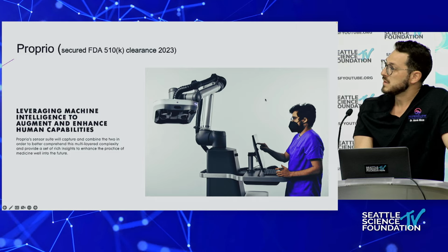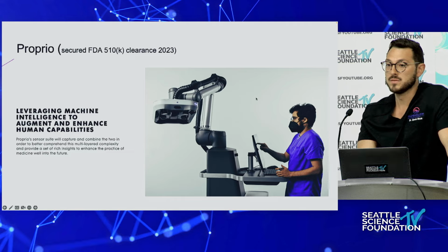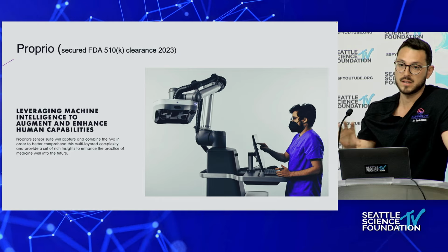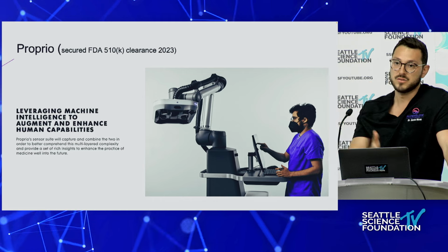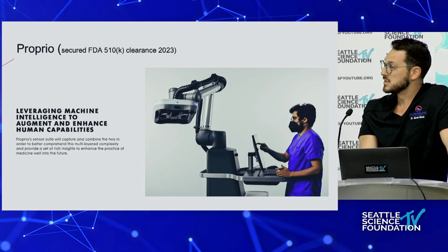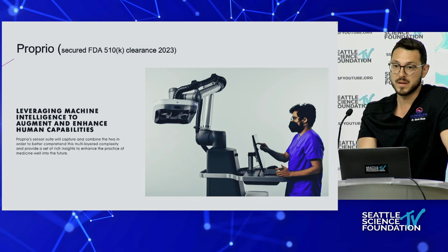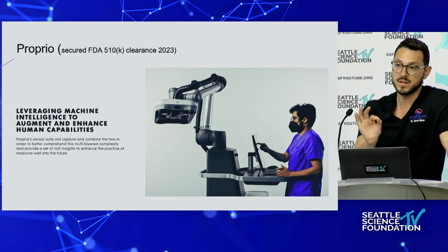The kind of distinction between some of these is that as we integrate AI into the imaging, it's going to be able to start helping the pre-procedural planning. There'll probably be a point in time where it will just start to know what exactly we want to do before we even need to do it. And you'll be putting on a display and the trajectory will already be planned. So it's very interesting technology. Most of this is being pushed through spine surgery. I don't really see that this is happening a lot in the interventional space. This group in South Korea seems to be kind of leading the way in terms of what we can do with a needle.